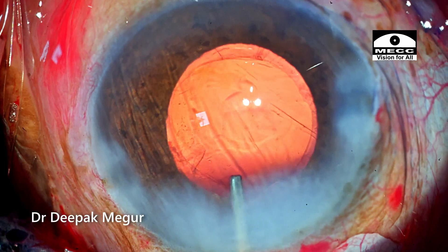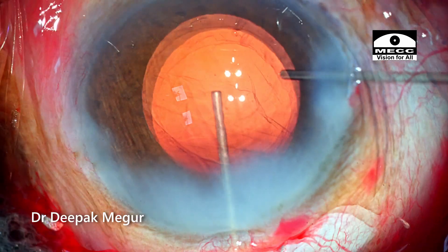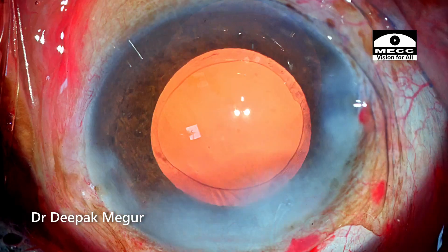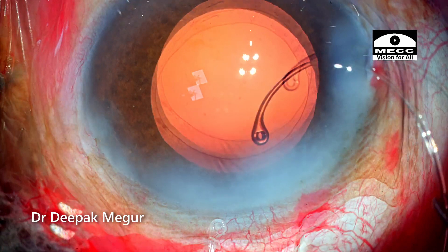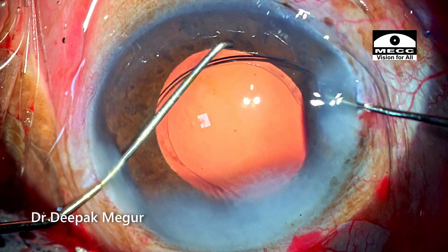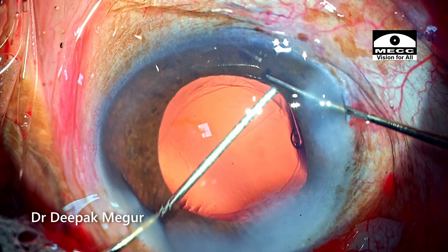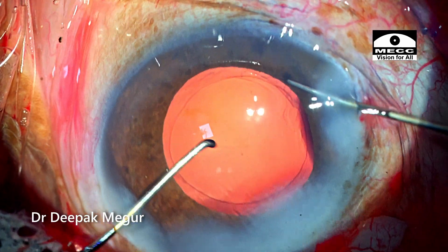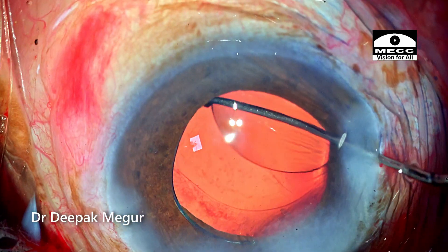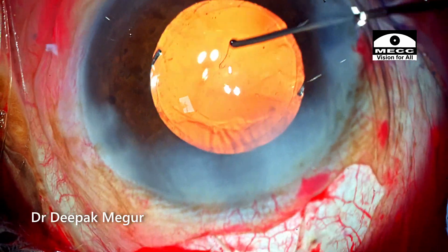I thought we have to stretch the bag and add some traction using a CTR. I'm putting OVD — sodium hyaluronate — into the capsular bag, and then the capsule tension ring is being threaded in. Let's see whether by inserting the CTR the folds in the posterior capsule disappear. The ring is gently manipulated into the bag. The capsule looks all right. The multi-piece intraocular lens is then placed into the bag, and I leave the lens there with OVD still inside the eye to maintain chamber form.